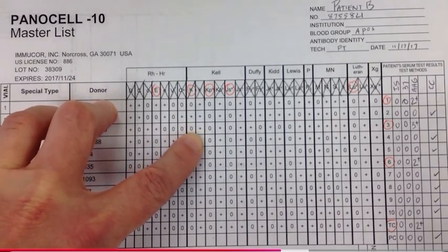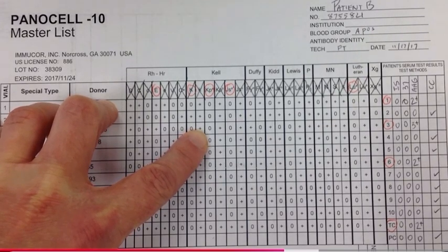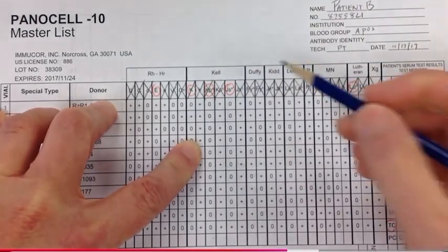Then you'd probably have to go back and take a look at your low incident antigens and see if those are what are causing the positive cross match. But since it's completely zero here, I'm going to go ahead and let that one go. I'm going to cross it out.